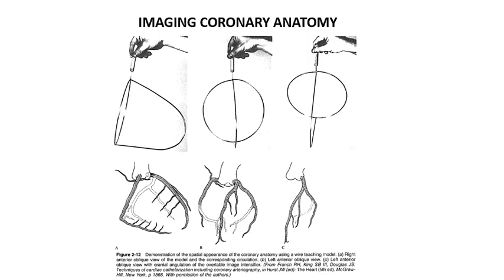Importantly, the coronary anatomies fit in specific locations around the heart. And if you look at the heart on its side, as shown by this wire, that shows you the LAD and the circumflex in these angles. If you look at the wire cage end on, this is that second shot we saw on the previous slide, looking at the heart end on. And there are slight variations on this where you tilt that end on position here to localize different parts of the coronary arteries. It's a very big learning curve to familiarize yourself with these angles, just to show you that unlike echo, we look at coronary arteries as a big part of our lives.